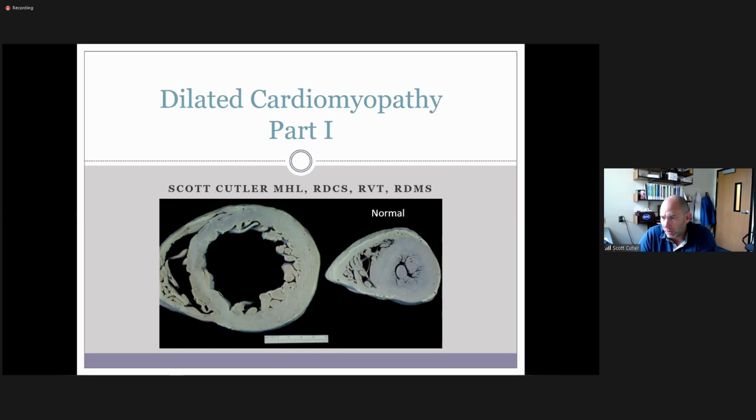The other thing to point out here is, as you're doing your echo and we think we're seeing those interior walls of the endocardium, notice how much trabeculation there is in that left heart in this dilated sample. What we want to see is the blood pool coming in here, even though some of these muscles are coming out.